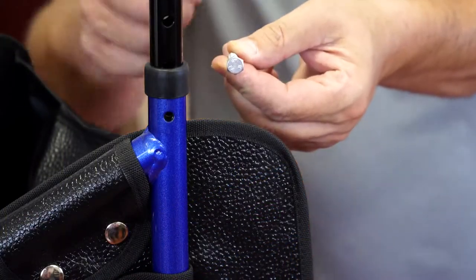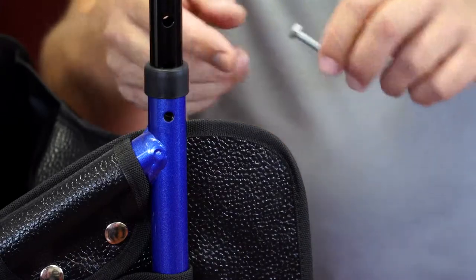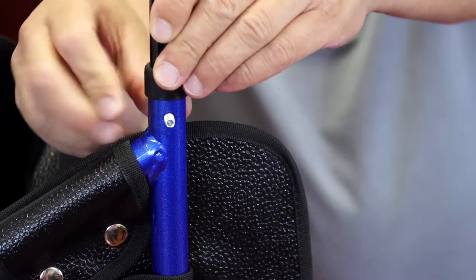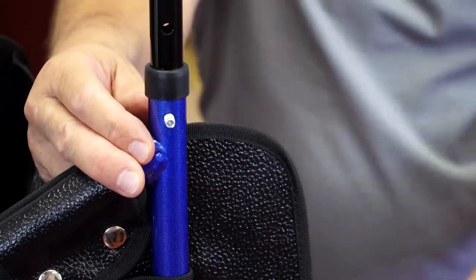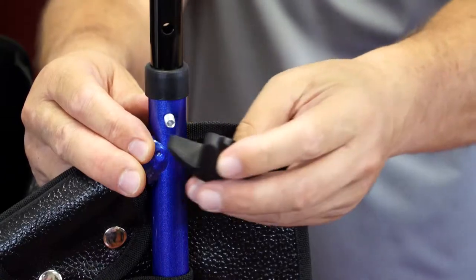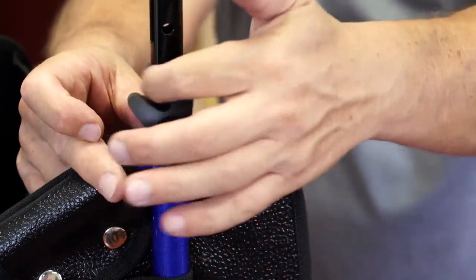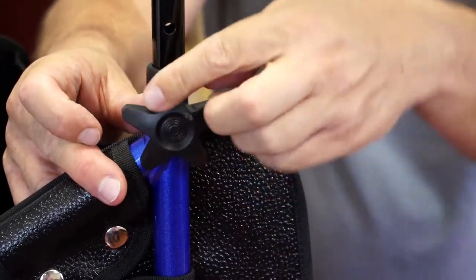Insert one of the steel bolts into the hole from the inside of the frame. You may have to wiggle the handle slightly to make the bolt go all the way through. Align the pentagon shape of the bolt's head with the pentagon-shaped indentation on the tube. Secure the bolt with the plastic knob on the outside of the frame. Screw it all the way, but do not over-tighten. The handle is now secured.